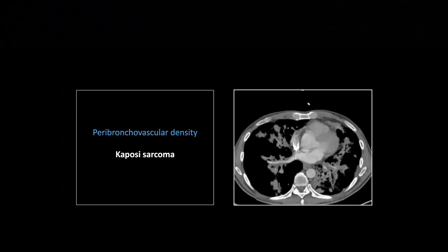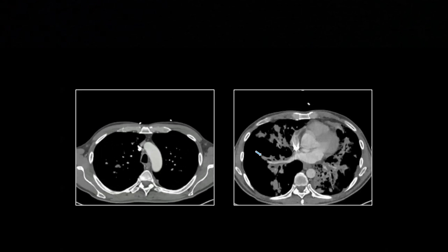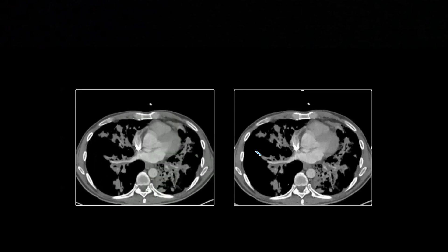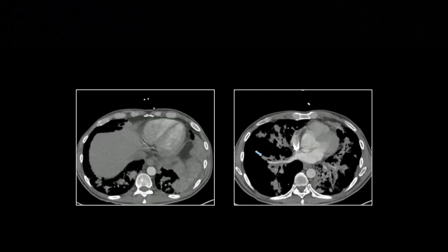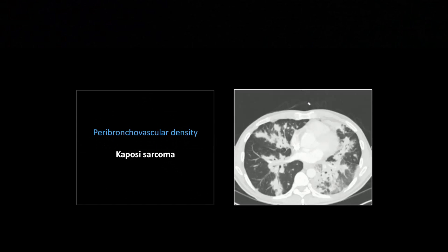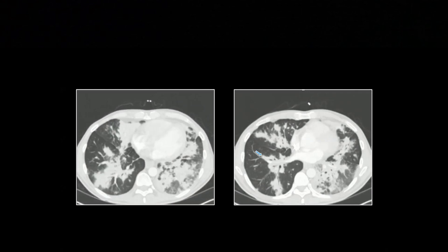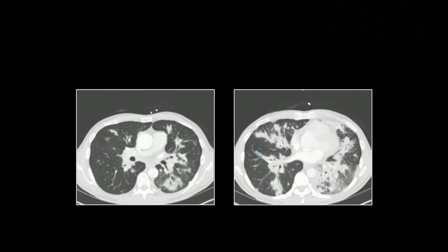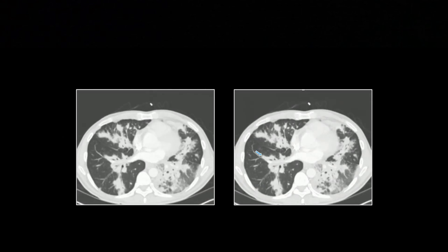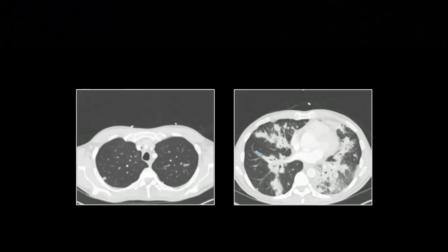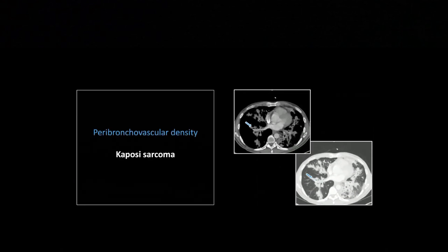Another peribronchovascular density. You can learn to recognize this, and also see it's pretty tough to sort out sarcoidosis versus Kaposi sarcoma. Density tracking along the peribronchovascular bundles — it's so dense that you can see it pretty well on soft tissue windows. When you get to the lung windows, it's going to be striking. You can really see the thickening around the bronchi — a perfect example of peribronchovascular density. So here it is on the lung windows: that is Kaposi sarcoma. Pretty tough to differentiate from sarcoid, but note — no mediastinal adenopathy, no splenic involvement — a couple of things not present that you'd expect for sarcoid.